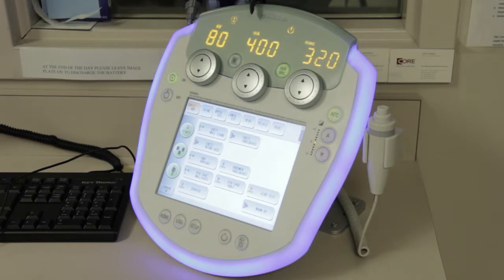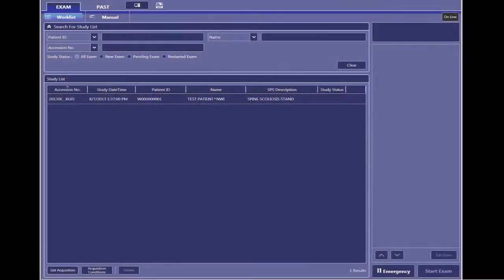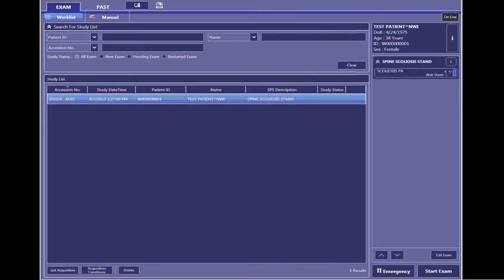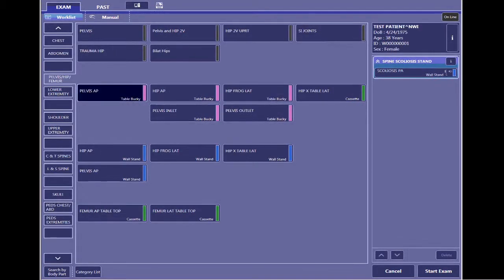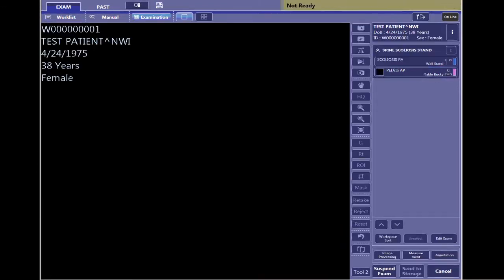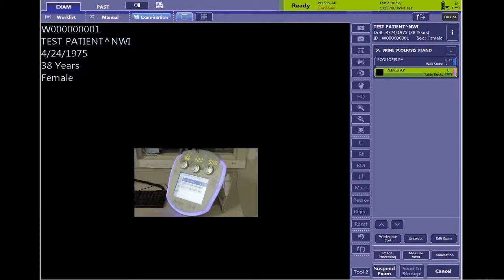We're going to go over some of the features of the generator panel. When you select your patient, it's going to automatically talk to the generator. Depending on your body part, it's going to pick the corresponding body part on the generator. Just because it's set to a particular preset does not mean you have to keep it that way — I'm going to show you how you can change those things.